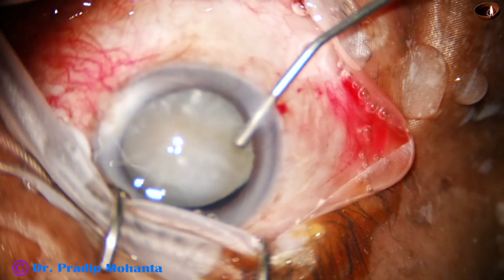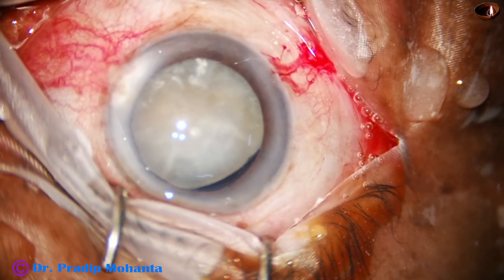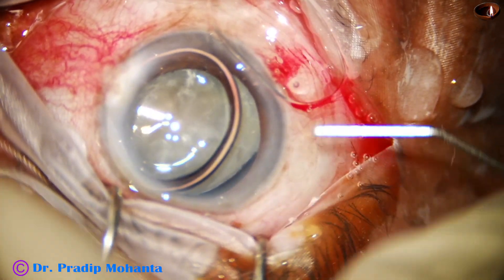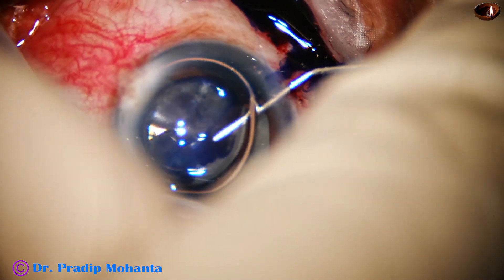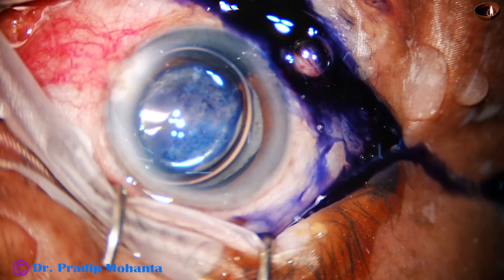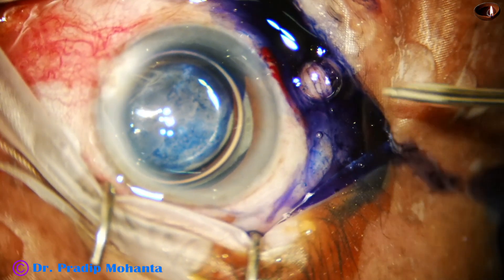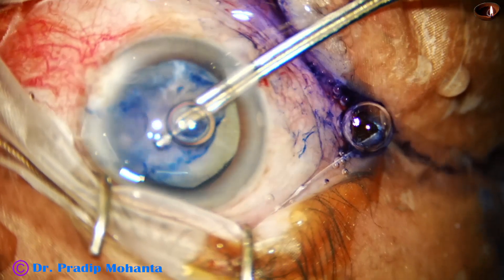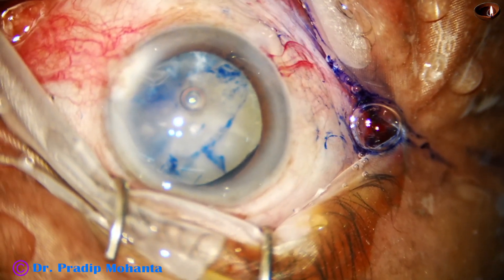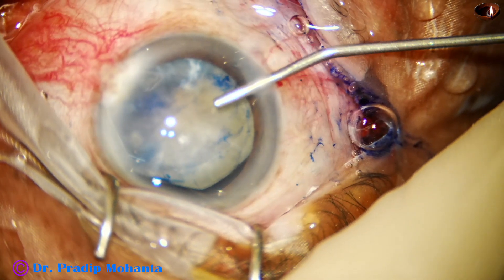Next, I inject some visco at the area of zonular dehiscence before staining the anterior capsule. I inject an air bubble, and then inject trypan blue dye over the anterior capsule. Since the area of zonular dehiscence is plugged by a viscoelastic substance, the dye doesn't go into the vitreous cavity. If the dye goes into the vitreous cavity, we lose the red glow and visibility becomes very poor. That's why this technique — plugging the area of zonular dehiscence with visco before staining the anterior capsule with trypan blue dye.